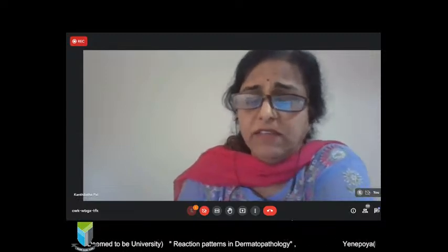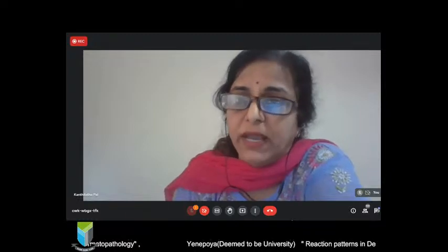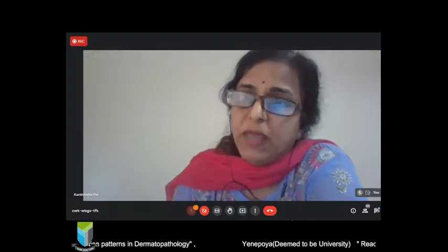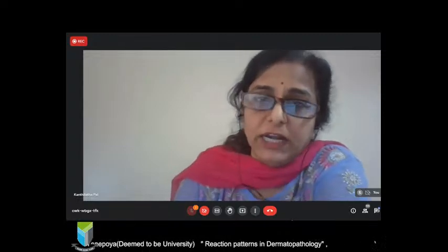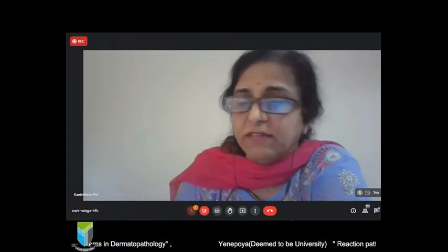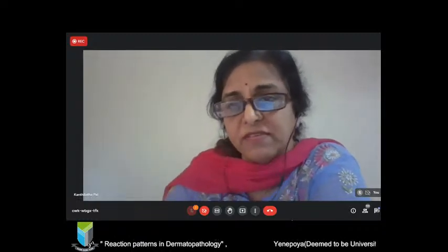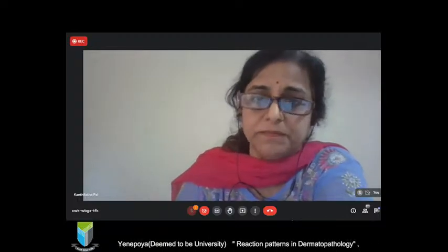Is it always required to find Munro's abscess or spongiform pustule to make a diagnosis? No. Many times we just see the other changes of psoriasis and Munro's abscesses may be absent, particularly if it's a partially treated case. But if you see the rest of the findings, you can suggest psoriasis and make a mention that the Munro's abscesses, which are characteristic of psoriasis, are not seen.